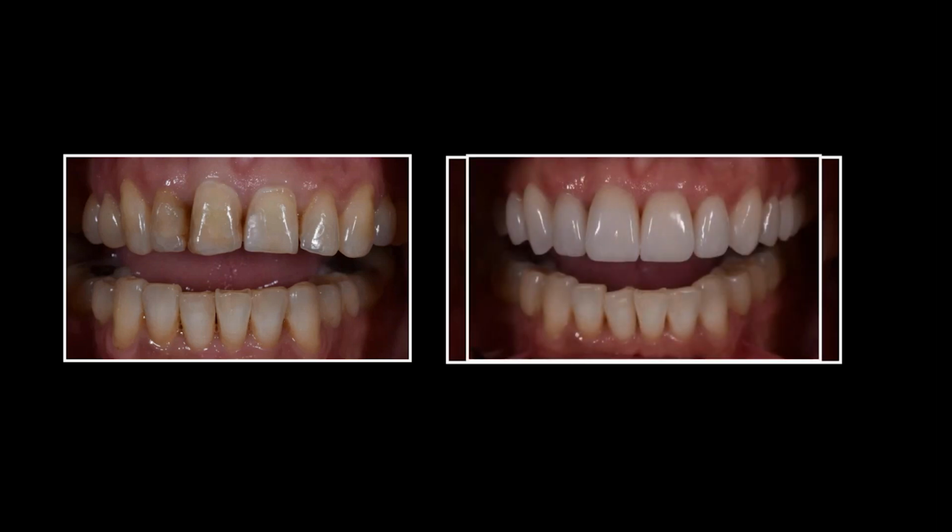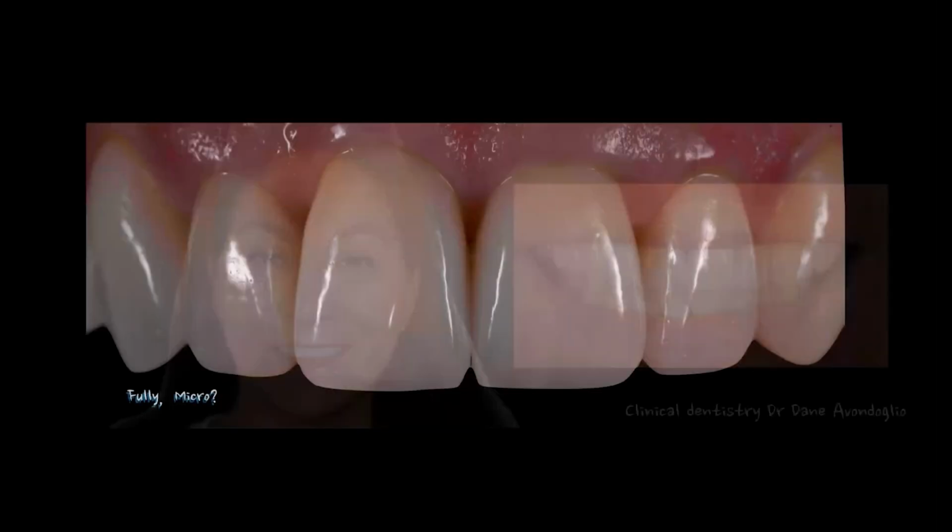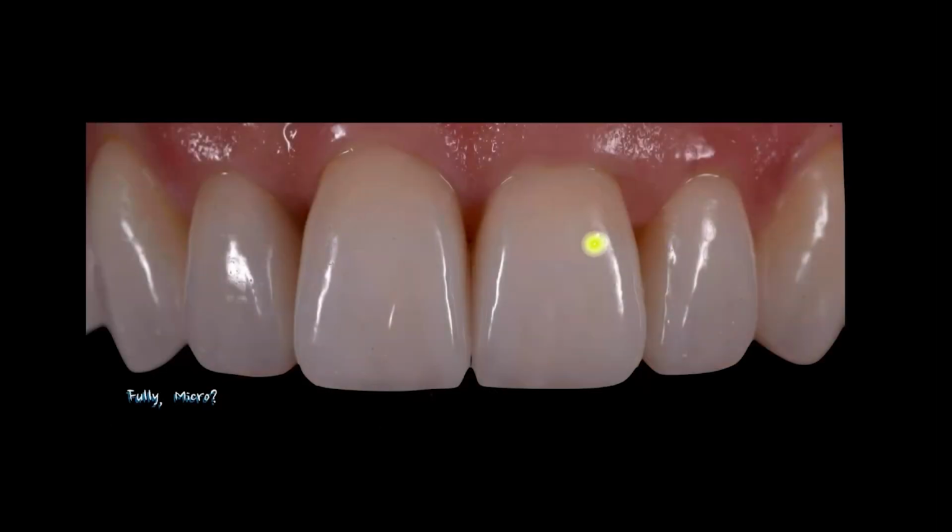So if you look at her harmony around the gingival, it looks pretty nice here. And if I actually bring it into a close-up, you'll see what I mean. So these are basically micro-layered veneers, but look at the tissue. And I'm going to say it looks pretty nice. I'm feeling almost happy with this at this point, where I think we're starting to get some of them in the lithium disilicate world to break that shadowing process that we've seen so many times over the years.